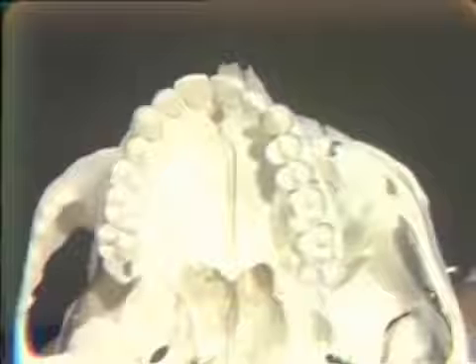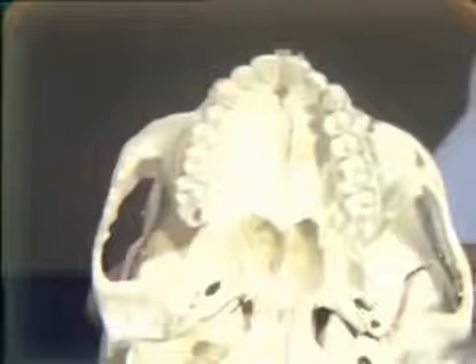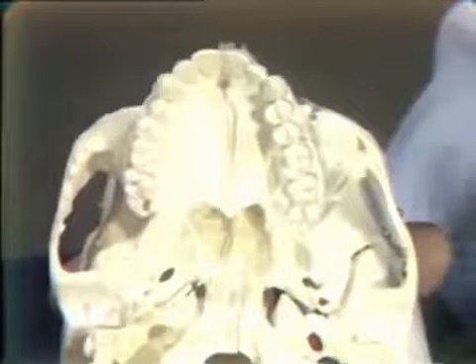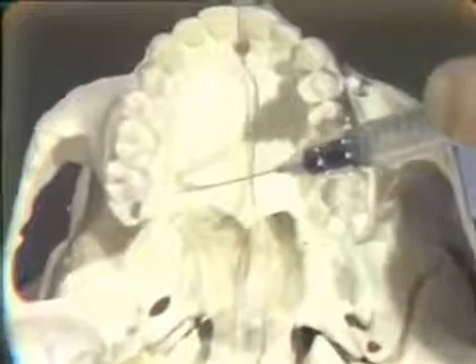You'll recall the anterior palatine foramen is on a plane anterior posteriorly with the third molar and approximately halfway between midline and the third molar tooth. So we would make the approach with the syringe with the mouth wide open so you can see nicely. And I am just anterior to the anterior palatine foramen in the third molar region, as you can see.